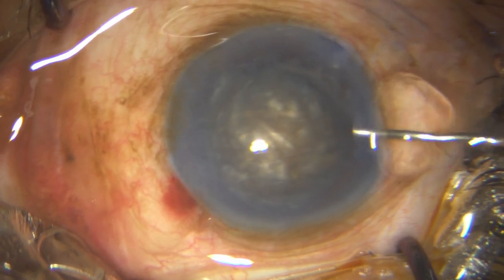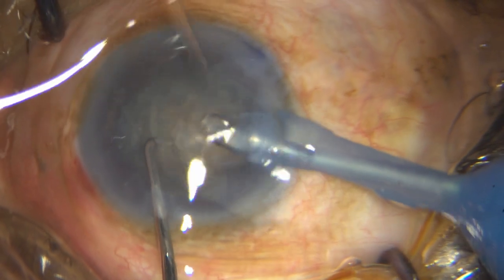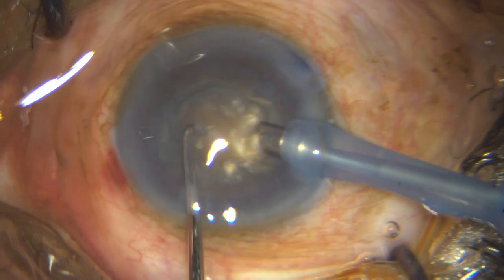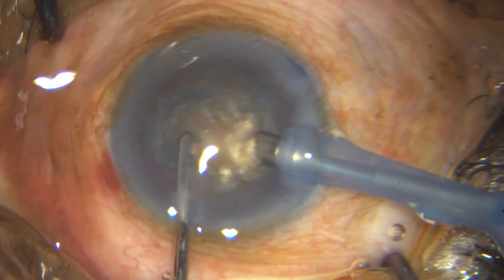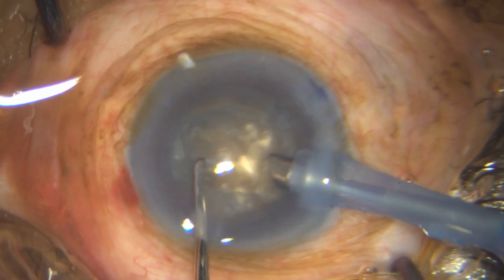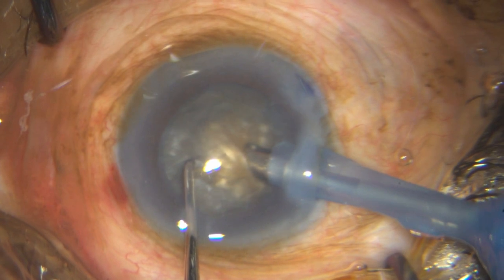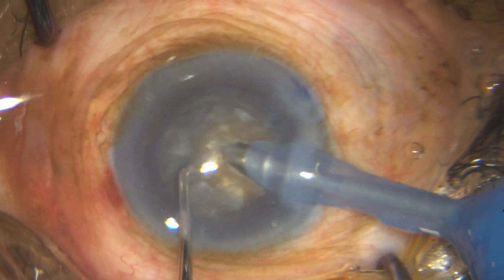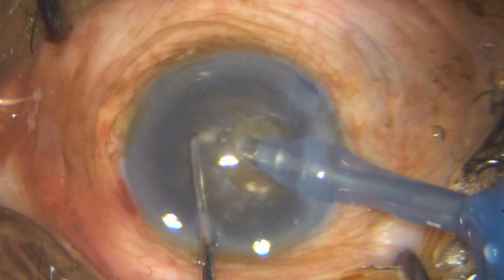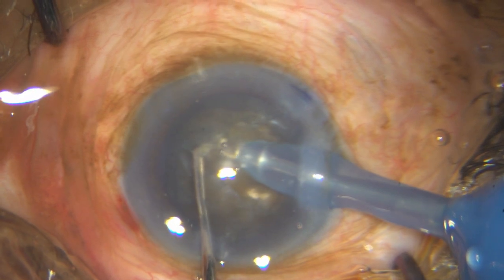Once I have got my hydrodissection, I put in some sodium hyaluronate just for extra protection to the endothelium, because I am going to use quite a bit of energy here. I'm at 80% phaco power — I may not be using 80% but that's a preset level — 400 mmHg of vacuum, and 40 ml flow rate. I am going to do the woodcutter's chopping technique, a very efficient technique for handling such cataracts.